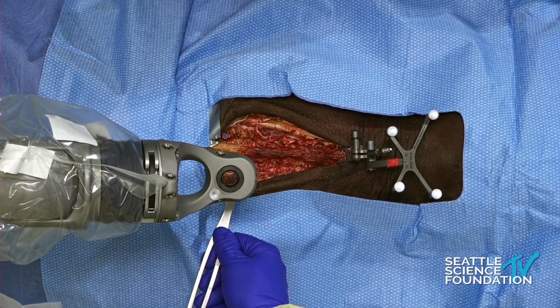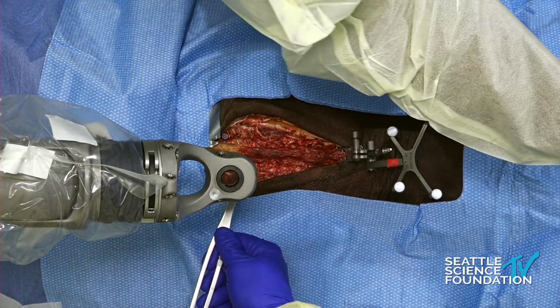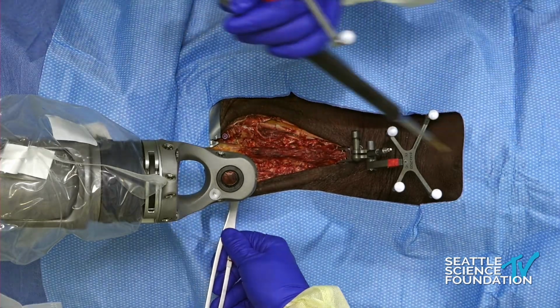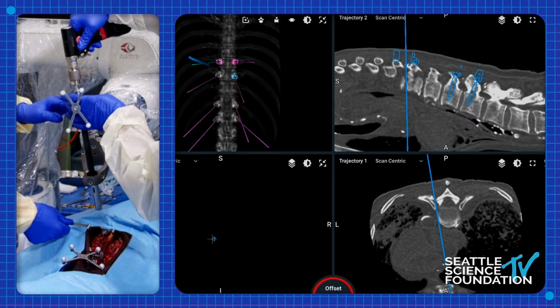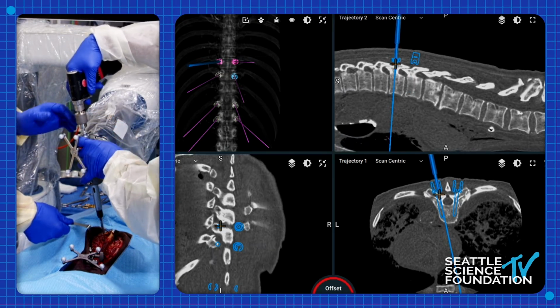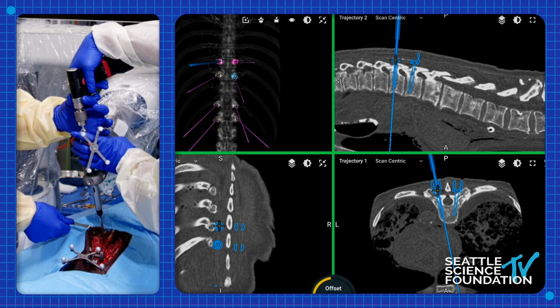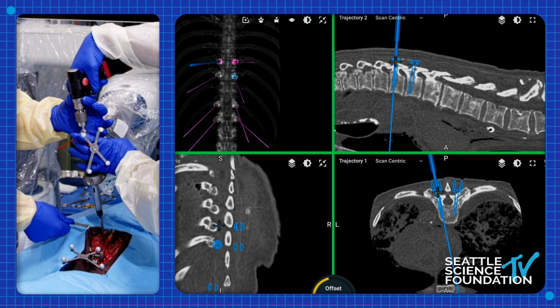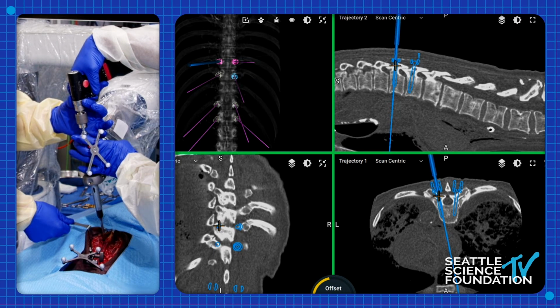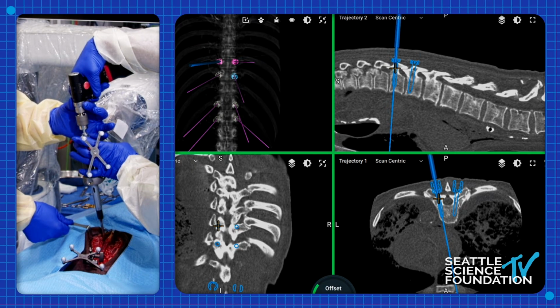We got Ian working today. Excellent. All right. And then we want to have this lined up and nice and green. If we have any concern, we can, let's see, where am I going to hold? I'll go ahead and start the drill. And it really doesn't take much with this device to get down. It's really very gentle.